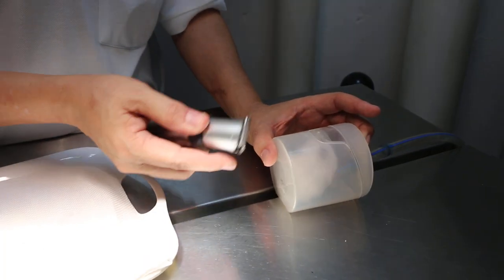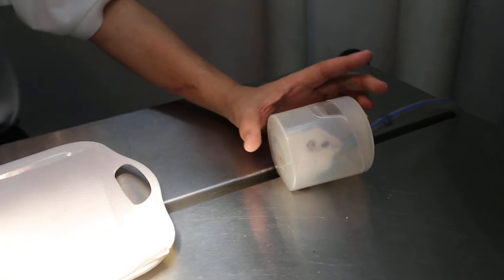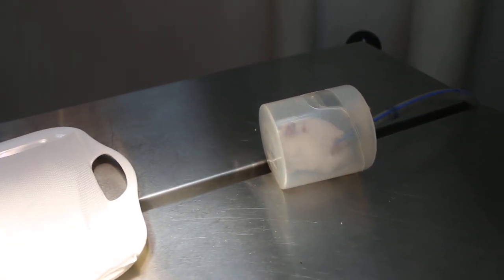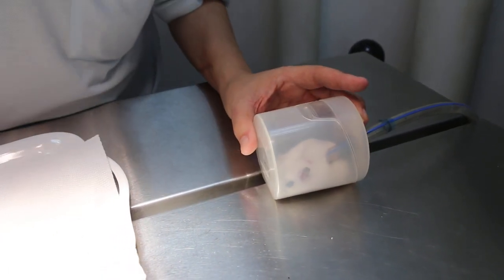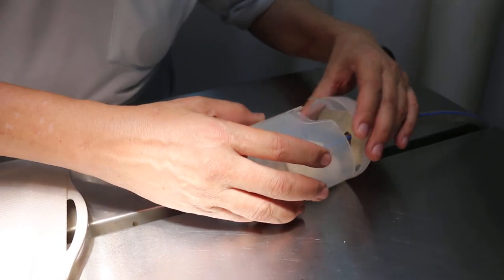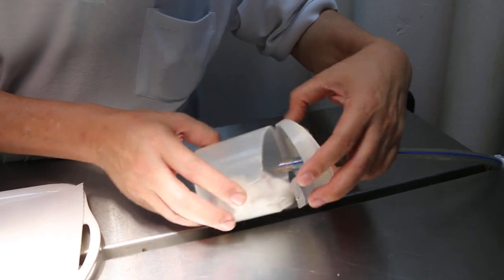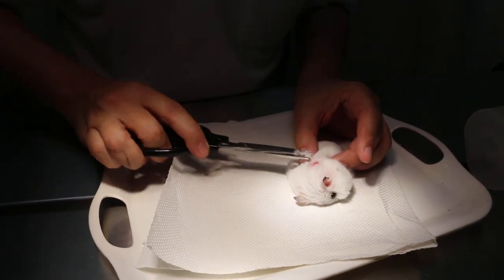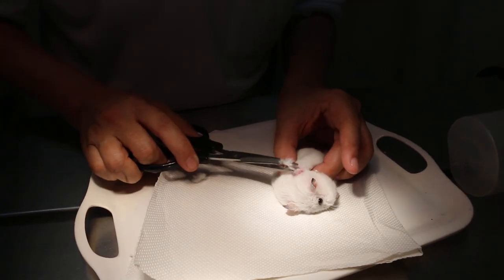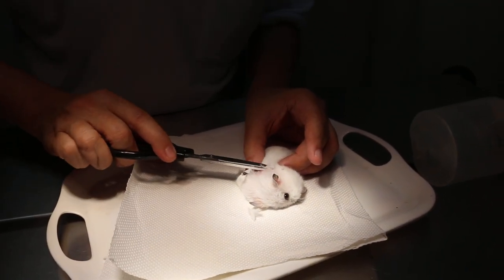The thing is that the battery must be charged — it just wasn't charged. So I will need to use scissors. Some of these batteries need to be charged and ready. Okay, now it's down again. If it can't stand up straight, that means it's down. So just point it out — you can see it's very light. Use scissors to cut; be careful not to cut the skin. This way, if there is any bacteria, it's easier for the hamster to heal.